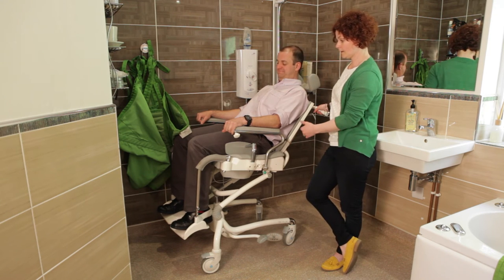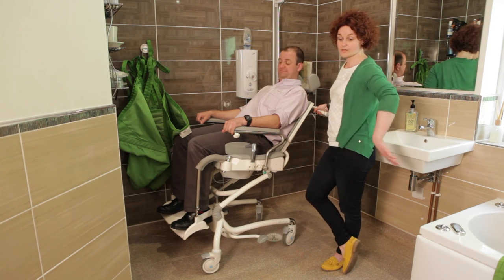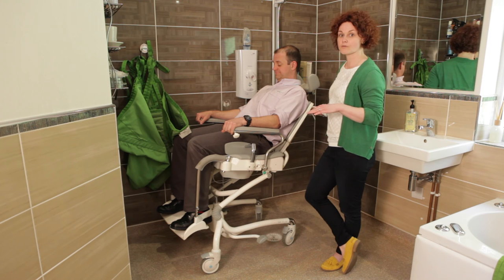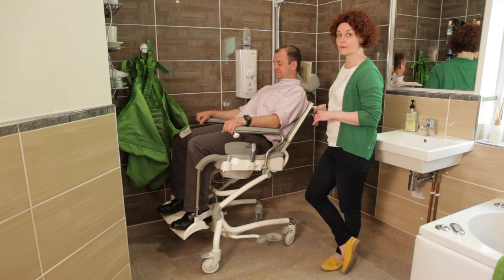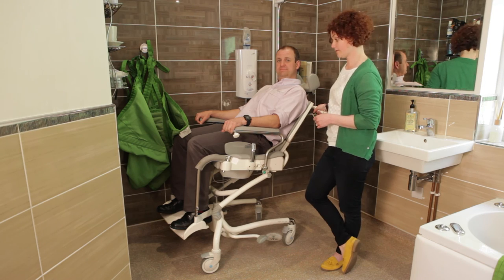And it means that I've gone from the toilet across to the shower, potentially via the wash basin, and been able to change heights and positions all the way along. So I think that's, from a carer's perspective, quite a useful feature really.